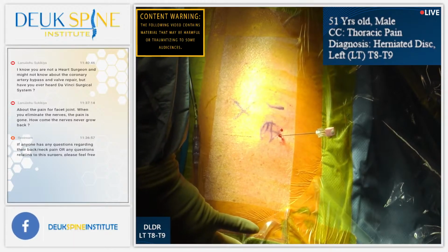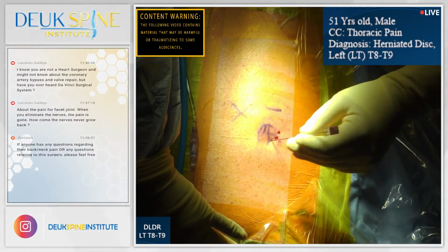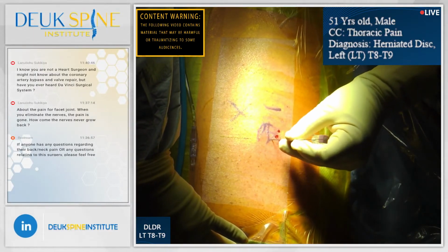All right. We're trying to get into this disc at T8-9. He's not making it easy for us.